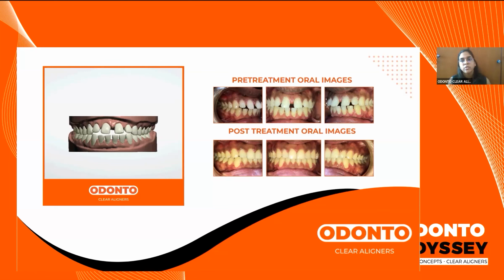We also have your PETG aligners, and then we have something which is known as the Zendura aligner, which is a slightly more advanced material in terms of it has better adaptability to the teeth. And if you have moderate and severe malocclusion which is present, then it helps you to track the teeth better.